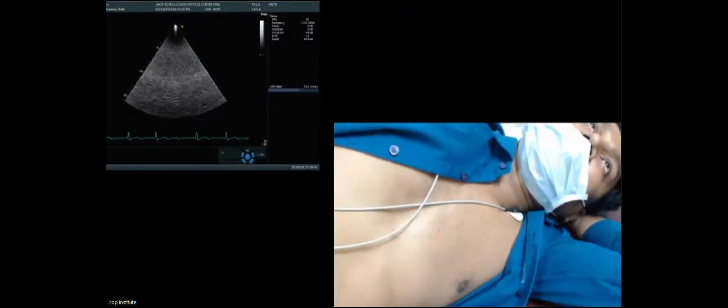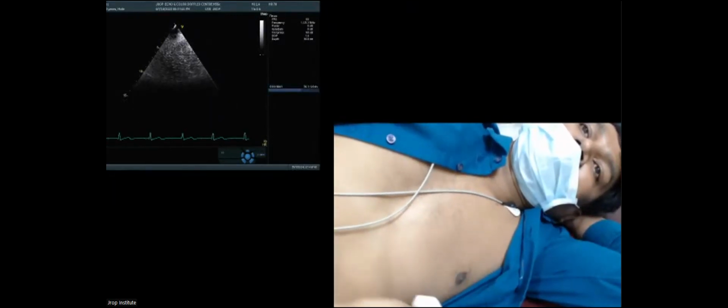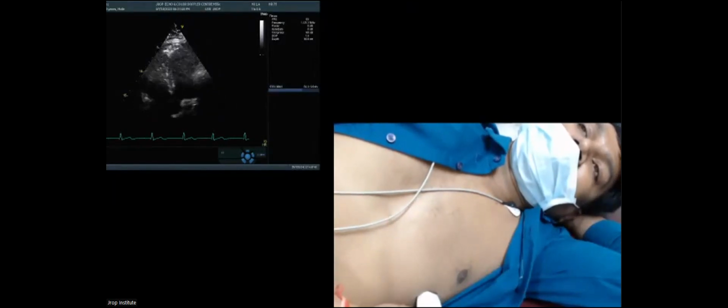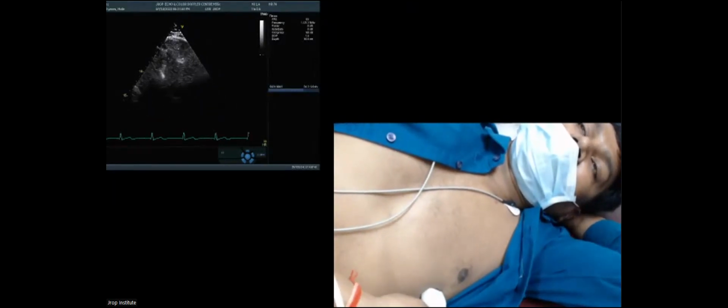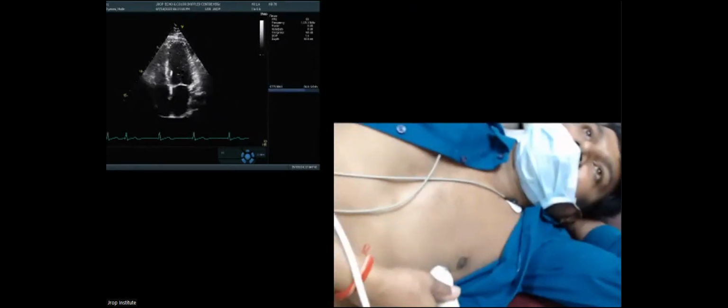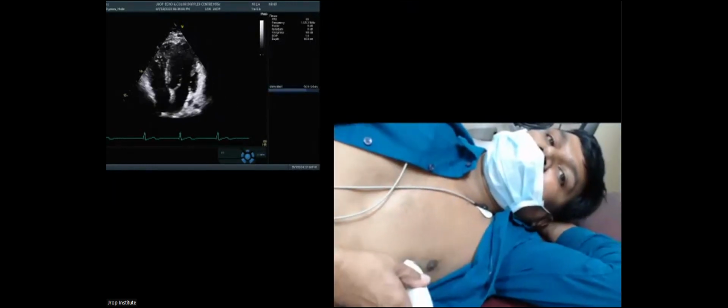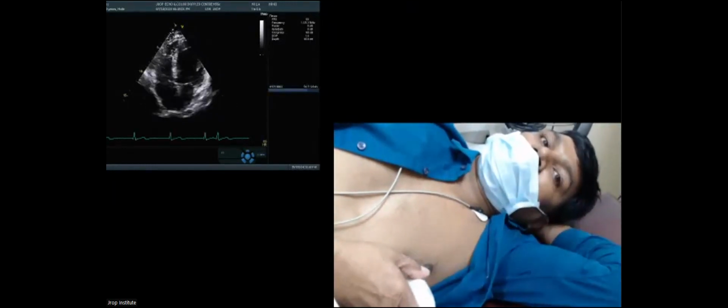All right. So his question was, in this 4-chamber view, if we see the left side of the screen but not the right side of the screen, what do we do? So I'm going to go a space up. Look at the camera, look at this.